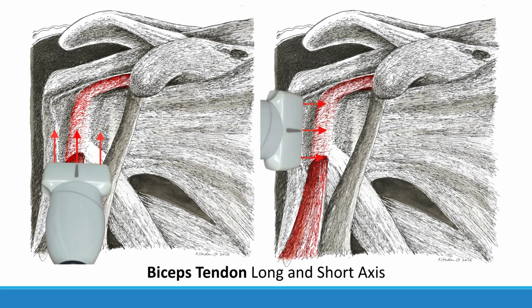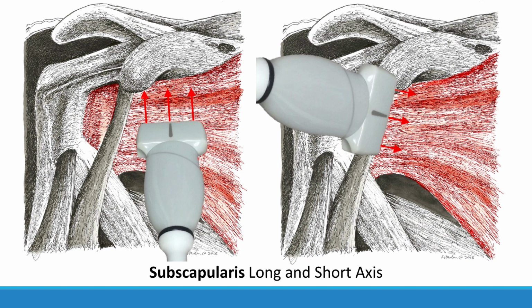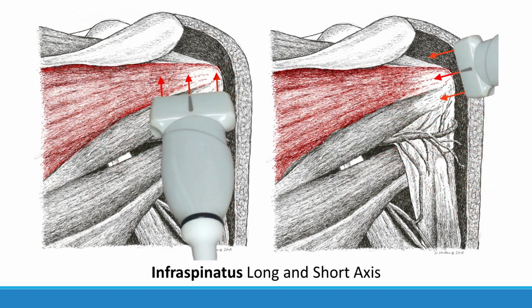two planes. And second from there, we're going to move to the subscapularis, view that in two planes, as well as dynamically, and look at its relationship underneath the coracoid, make sure there's no effusion and that sort of thing, and we'll watch the shoulder internally and externally rotate and look for the quality of tendon gliding in that view. And then we're going to move laterally and posteriorly and look at the infraspinatus, its insertion and footprint, as well as slide back posteriorly, identify the muscle tendon junction.